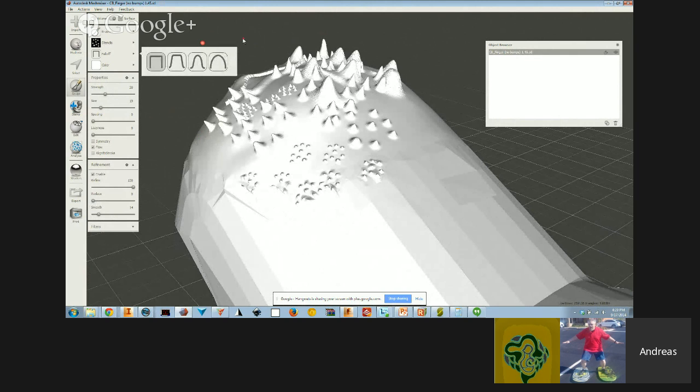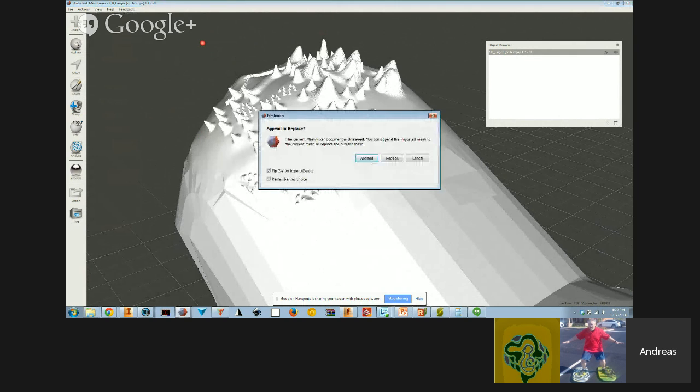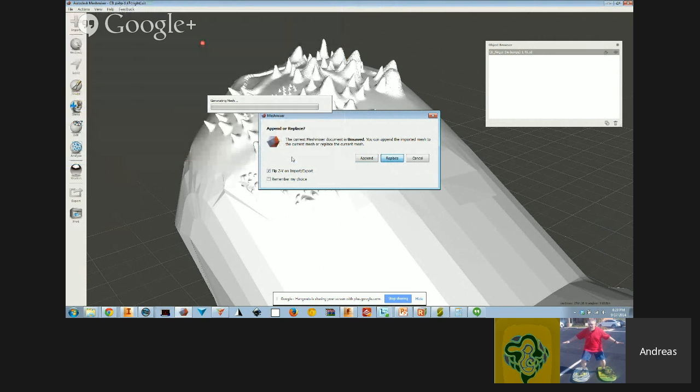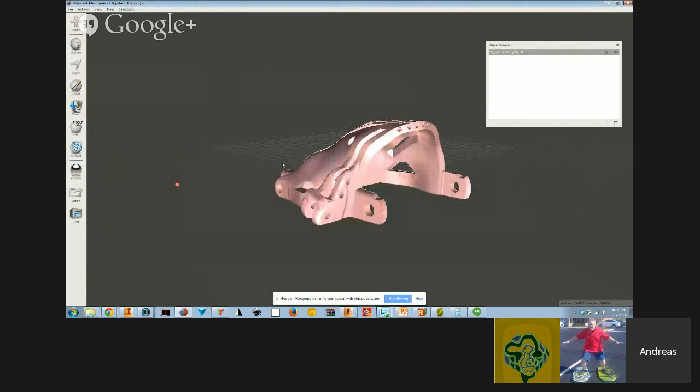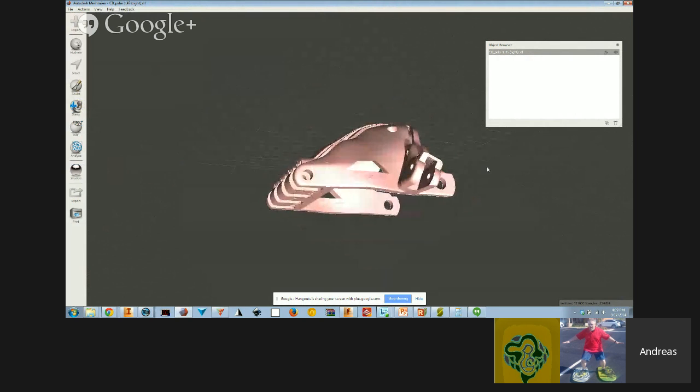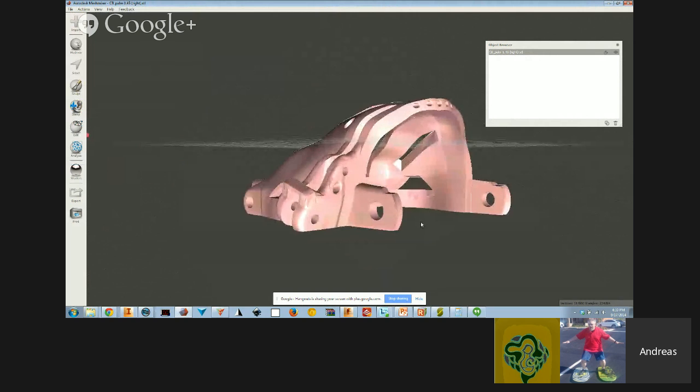So, if I go to import, I'm going to bring in, I have to leave this on since I think that's what we're doing. I'm going to replace to get rid of this finger, and I'm going to bring in the palm. Open. And now my scene's replaced with this object. And it's sort of oriented correctly for printing. I believe that's flat on the bottom.